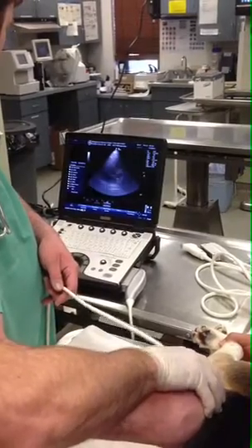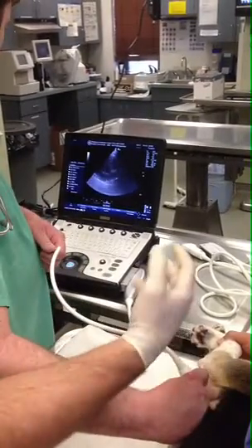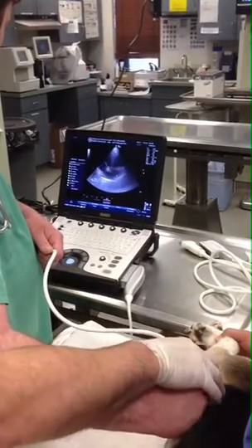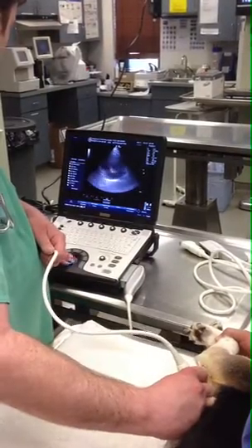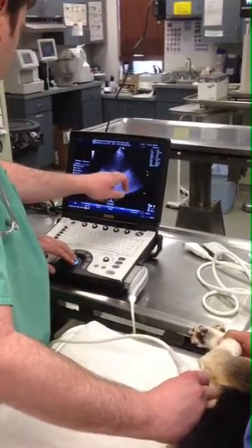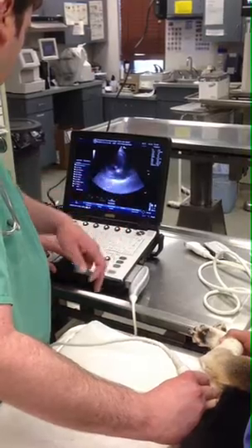Just change angles a little bit, keep the pressure down, collapse that lung. Beautiful. Right atrium, right auricle here — tricuspid's coming in and out. This is the right auricle. Your tumors are usually going to be right there. Beautiful shot right there.